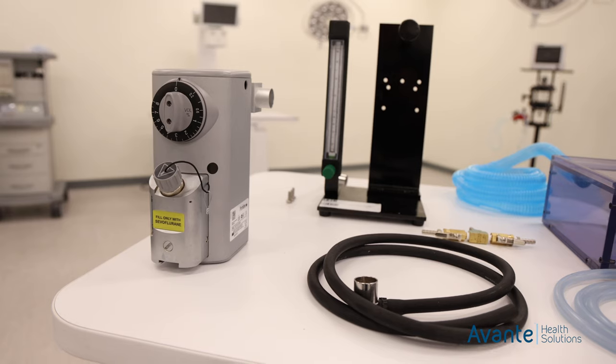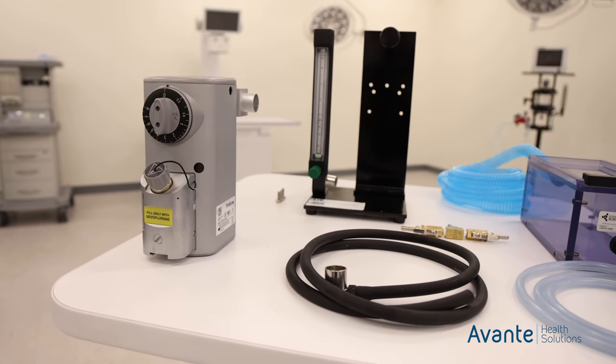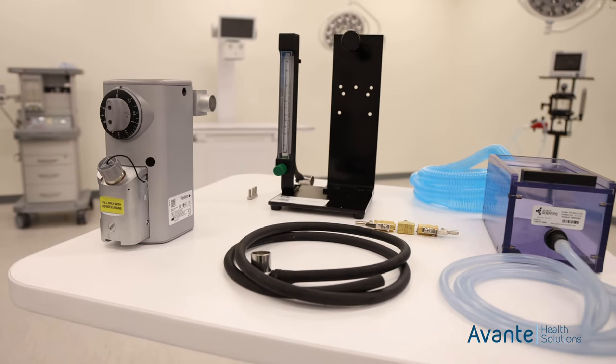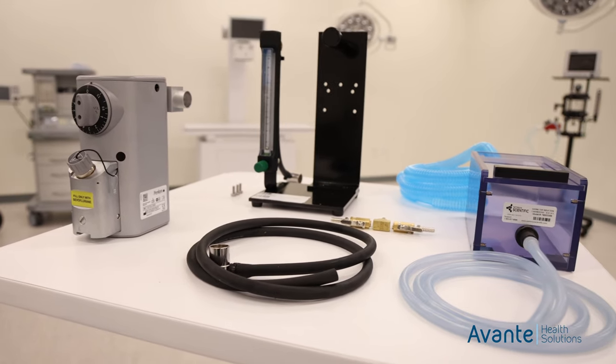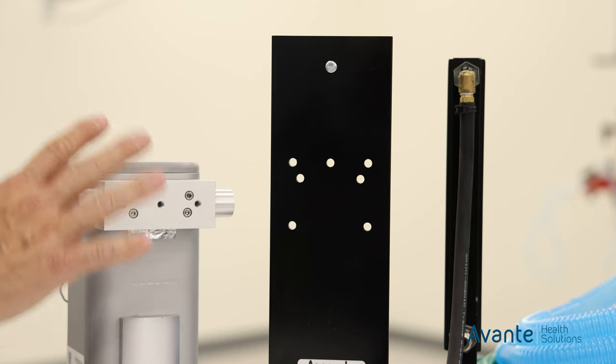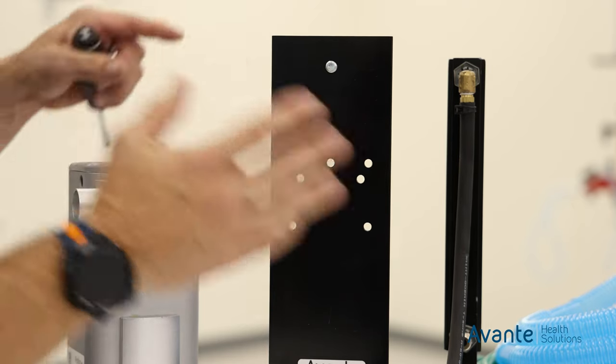Your Compact Mini anesthesia machine will consist of the machine itself, a cage mount vaporizer, an inlet and outlet cap, two neoprene hoses, a three-way splitter, your induction chamber, some scavenging tubing, and a couple other parts.